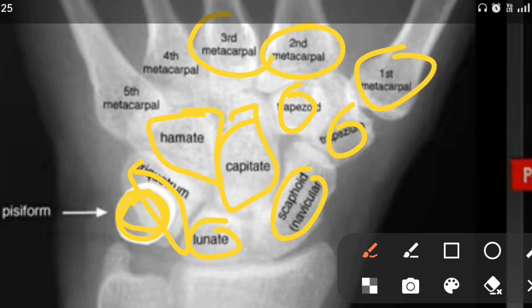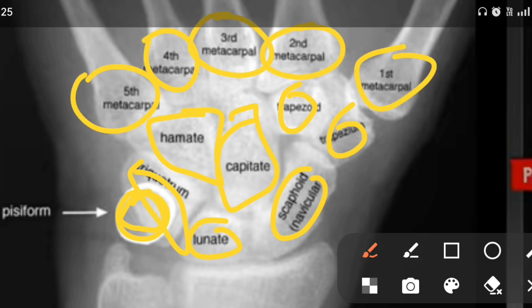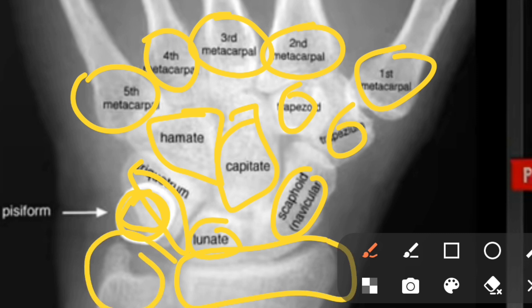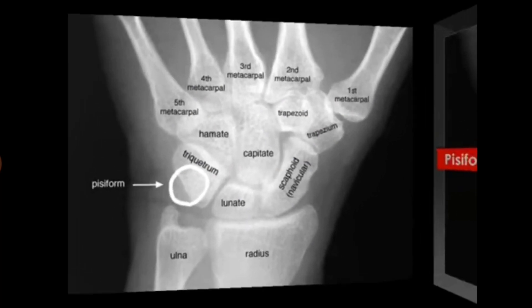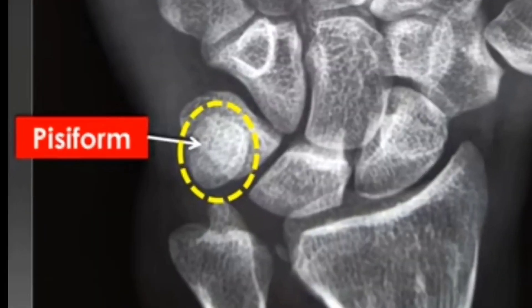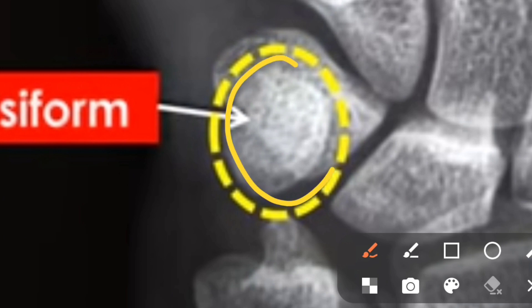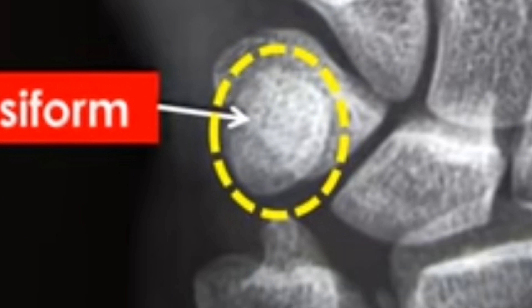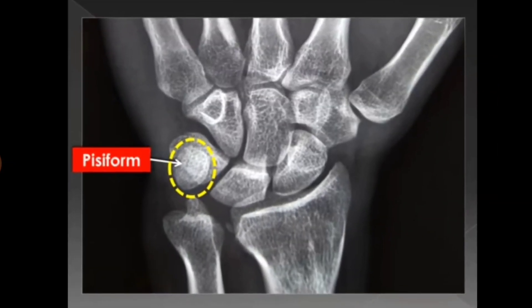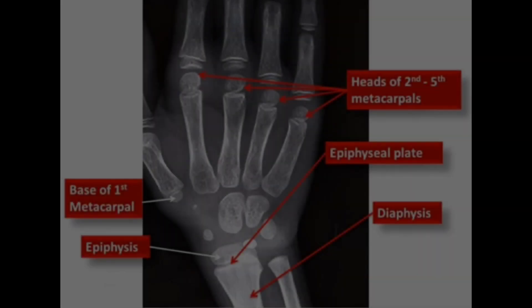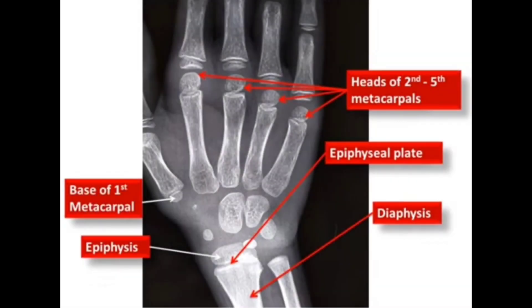The metacarpals are first, second, third, fourth, and fifth. The lower end of the ulna is here. The head region is the upper end, which is on the other side. You can see this is the head — the diaphysis — the surface of the first metacarpal, and the second to fifth metacarpals.